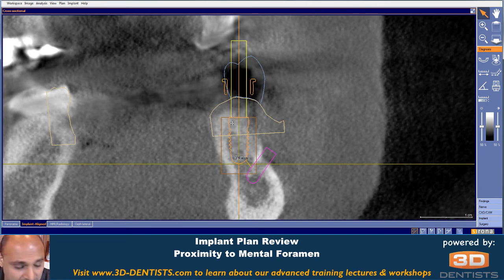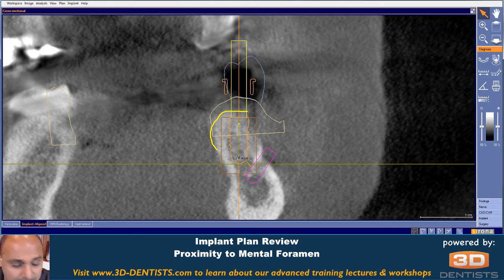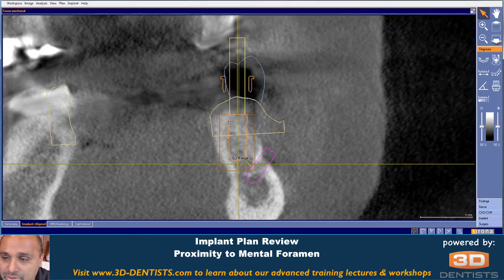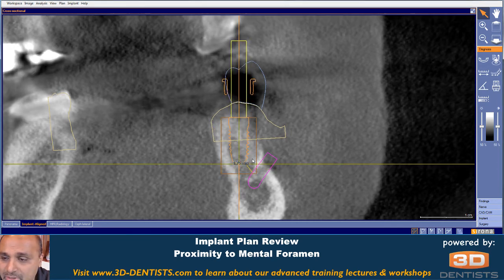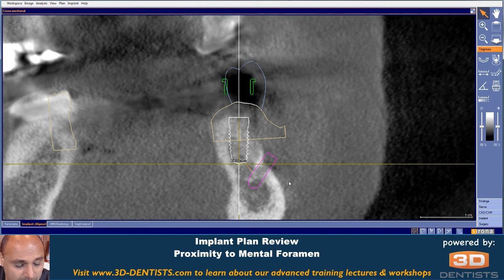One option here is I'm seeing that our bone ridge is probably more along that height. So one option is to move the implant up, and now suddenly we go from 1.7 millimeters of space to about 2.2 millimeters of space, which is certainly much more tolerable in terms of risk of damage.